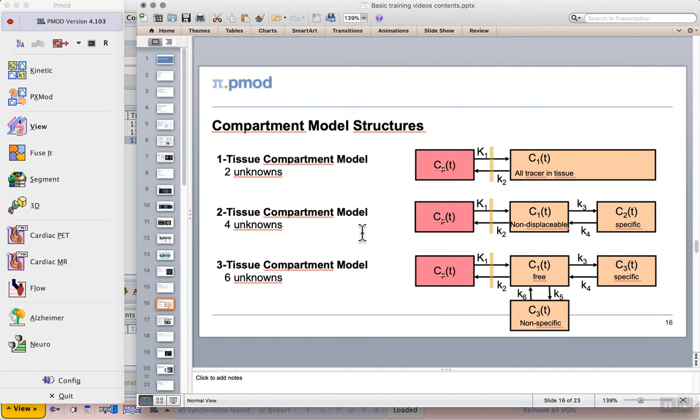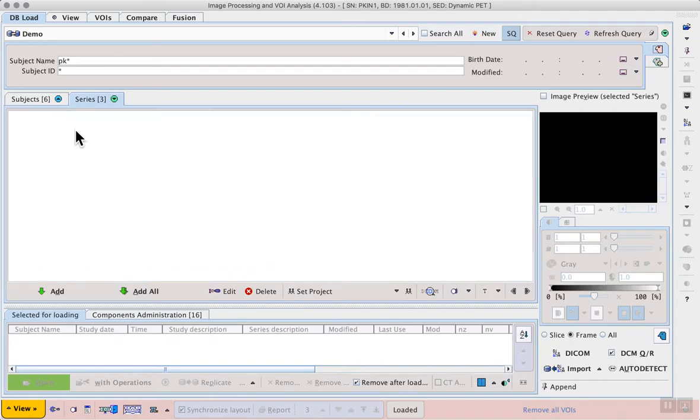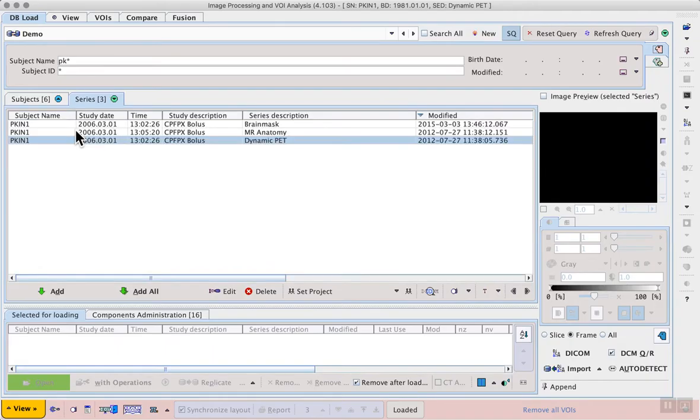To find out more about kinetic modeling, you can see our documentation and there's also more information provided in our basic application course. To perform kinetic modeling we first need time activity curves. For this reason we will start in the view tool.